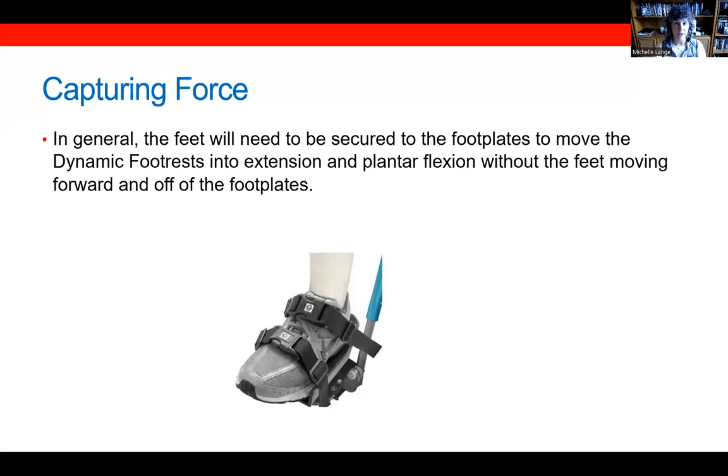Now, to activate the dynamic footrest, the client's feet will need to be secured to the foot plates. Otherwise, as the client extends, their feet will simply move away from the surface of the foot plate rather than activate the dynamic component. So it's important to use some type of shoe holder with straps, ankle huggers, something along that line, but fairly secure to the foot plate. If there's much movement between the foot and the foot plate itself, then the system will not be as readily activated.